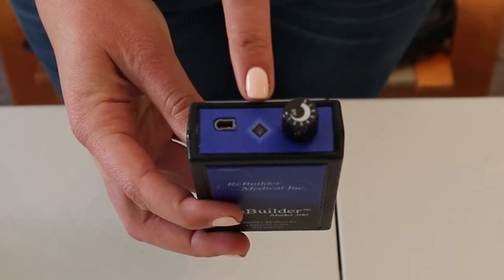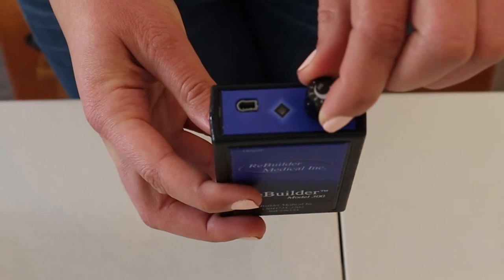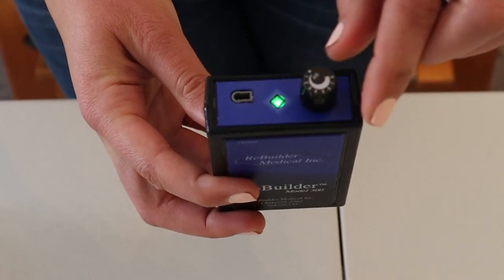This is the power indicator for the Rebuilder 300. Twist the power and intensity switch to turn on the Rebuilder 300.